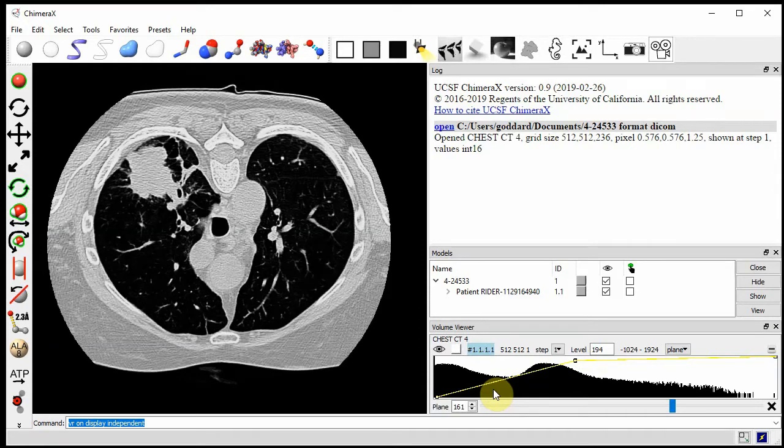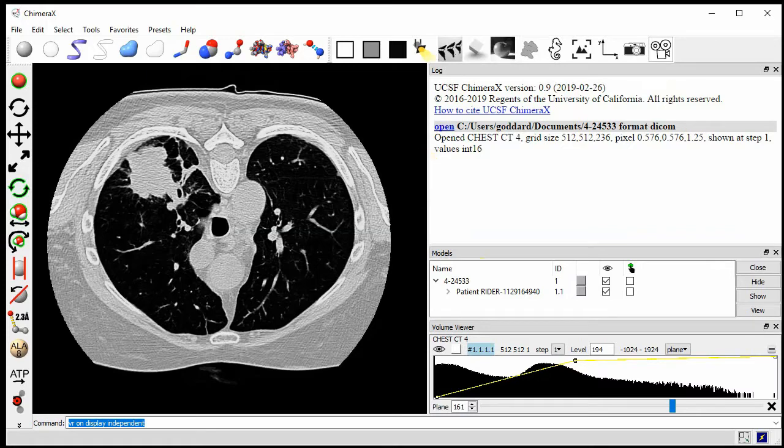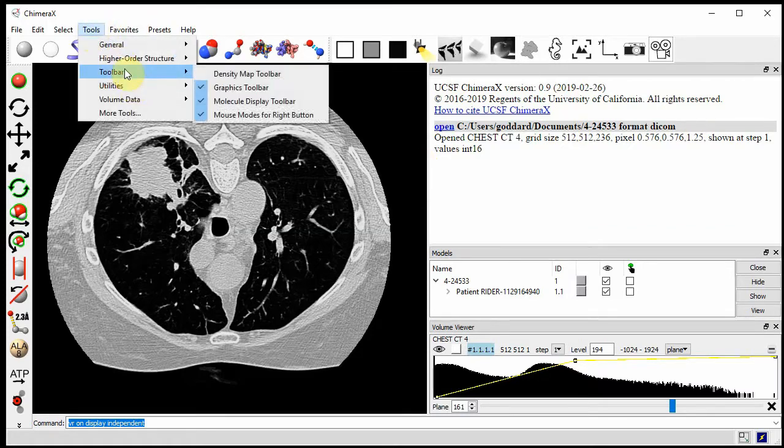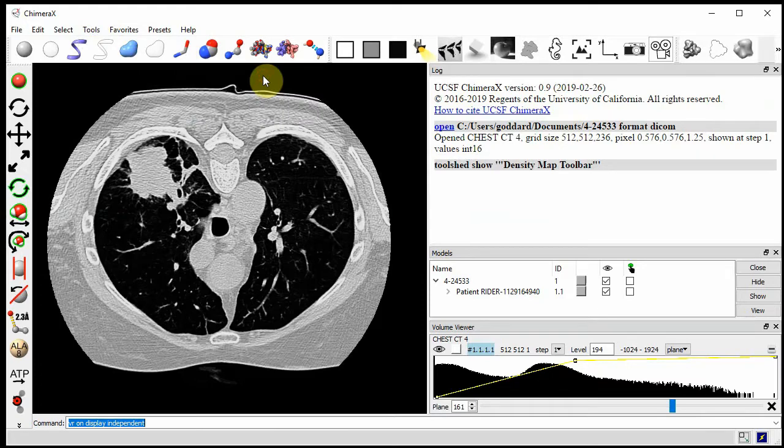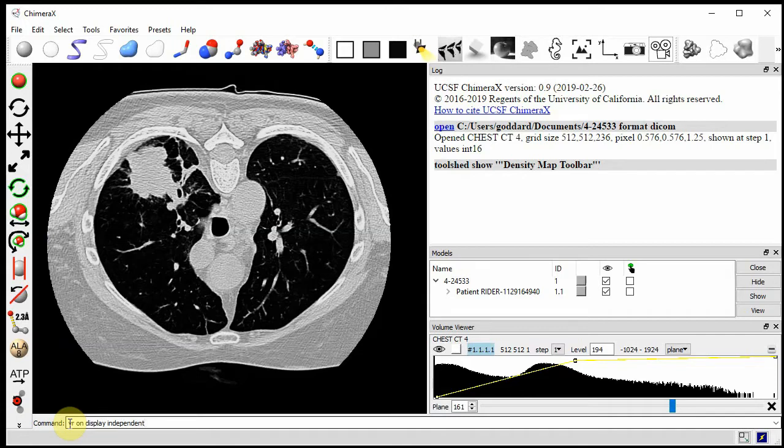Let's switch to virtual reality. The first thing I'm going to want to use is a toolbar in virtual reality that's not shown by default. I'll show that under tools, it's called the density map toolbar. I'll show that and enable the VR by typing the command VR on. I'm going to use an additional option that's just for recording this video, display independent. You won't need that if you're using the VR. Let me untangle my cord from my VR headset.